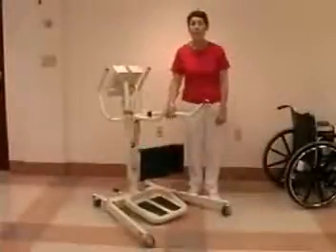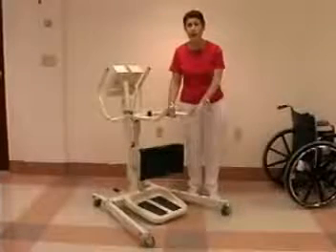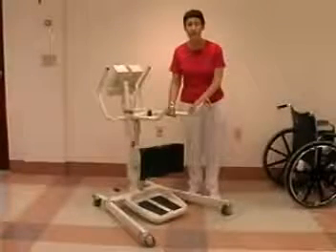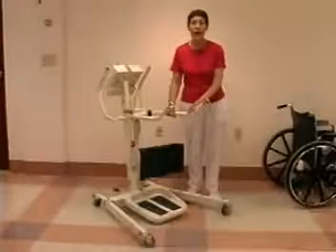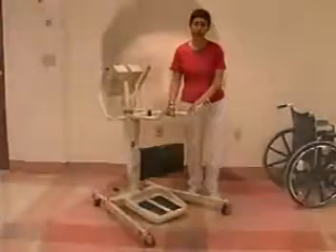The sling should be washed when it becomes visibly soiled. Mechanical lifts have weight limits. This particular lift has a weight limit of 350 pounds. Always check with the nurse to find out the weight capacity of the lift that you're going to be using.